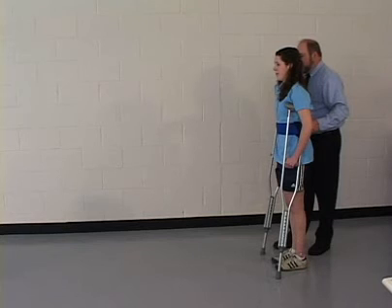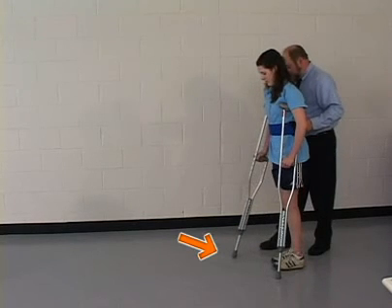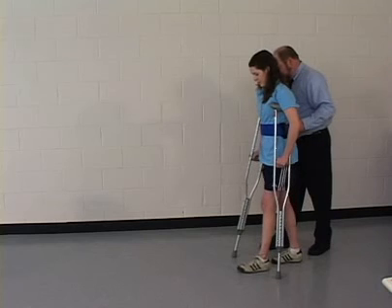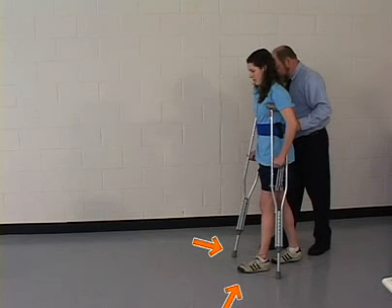To move forward, the patient advances one crutch. The right crutch is advanced first. Then the therapist advances his right or outside foot. The patient advances the opposite lower extremity to a point even with the tip of the right crutch. She shifts her weight to the right crutch and left lower extremity.